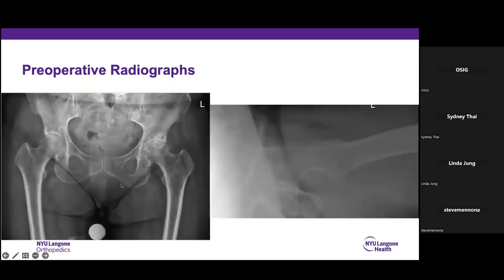Now this is a pelvis X-ray. Okay, this is a good hip. This is a bad hip, and you can kind of see that the black space in there, that's joint space, whether it's cartilage, synovial fluid, but that space right there is smaller than over here. So this hip is arthritic and it's painful. So you would do something called a total hip replacement.